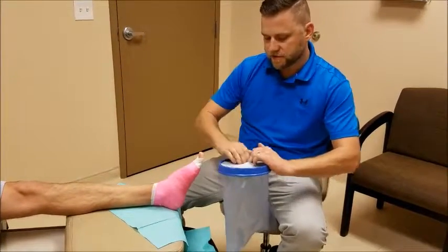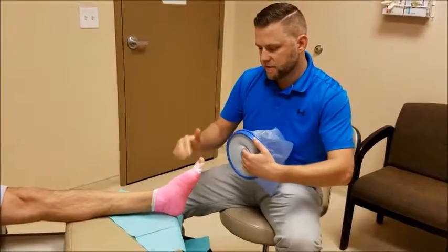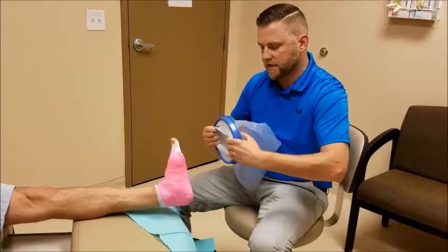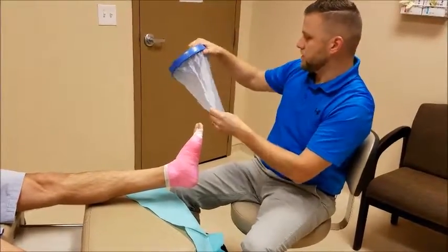When you apply this, first and foremost, you need to open up the hole. It is rubber, so it will tend to grab to the skin or to the dressing, so you're going to open that up as wide as you can. Then you slide the foot inside, making sure that the toes are in the right direction.